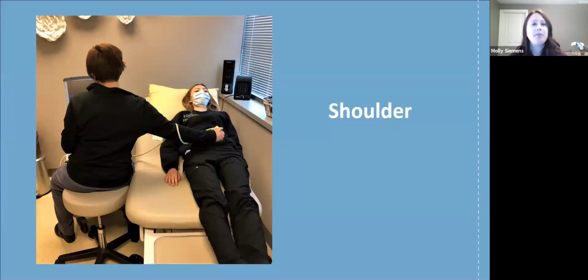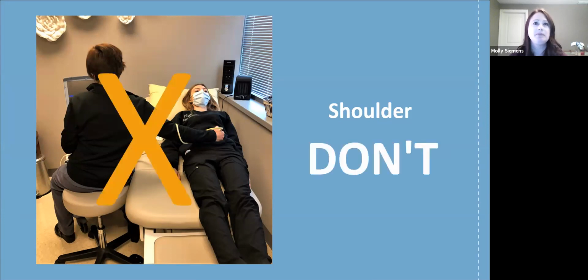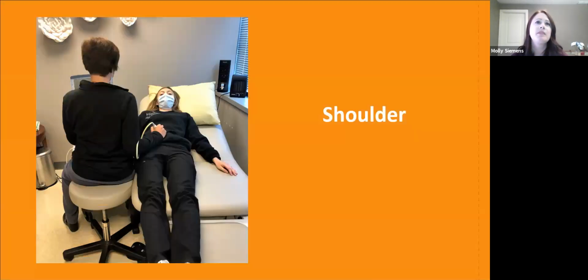While inappropriate bed or chair heights can contribute to overabduction of the arm, an inappropriate patient position can also lead to overabduction of the arm. One of the first things that we should do after adjusting our chair or bed height is to have the patient move as close to us as possible.